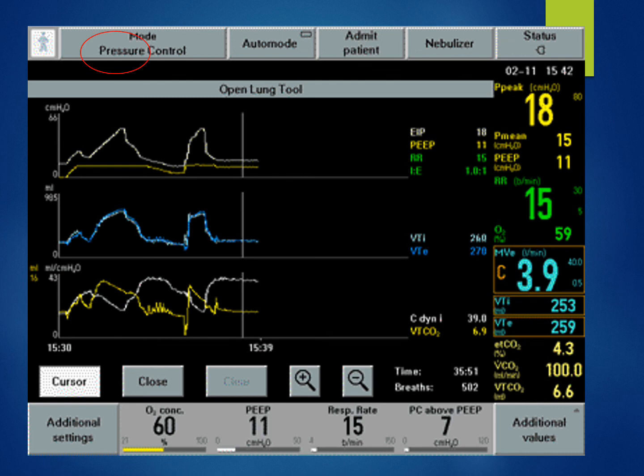Know that there will be a variety of different ventilator models and screens. So the point is not to memorize this one screen and where everything is on this one screen, but the point is to learn how to search for keywords so that you can make sense of what the ventilator is doing and what your patient is doing.